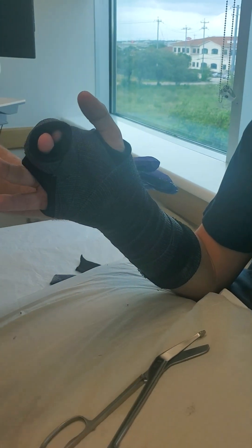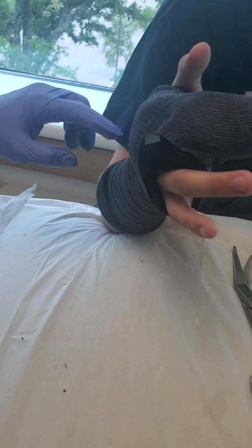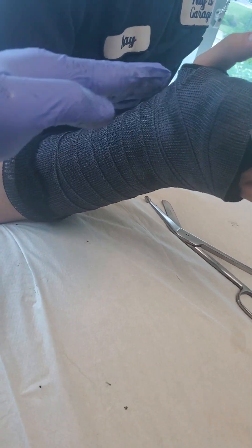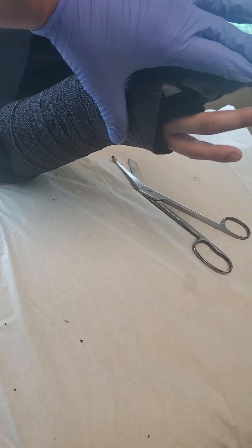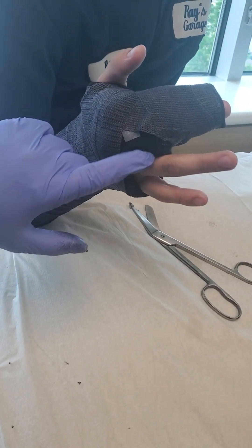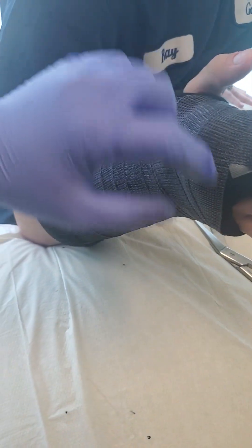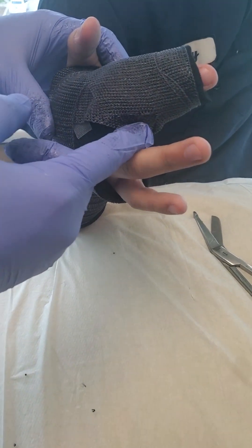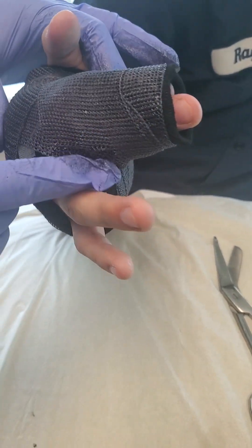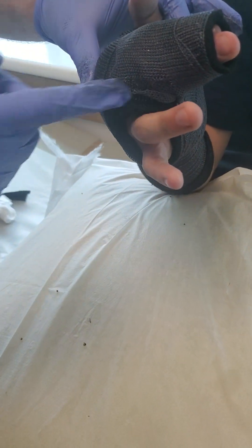While the second fiberglass gets ready, check the different angles: you can see the wrist is straight like an arrow — you don't want it to drop down. The fingers are bent down, there's plenty of padding on all the edges to protect from the cast edges. If you look here there's a nice gap between the ring finger and the middle finger, giving him full function of that finger without needing moleskin.